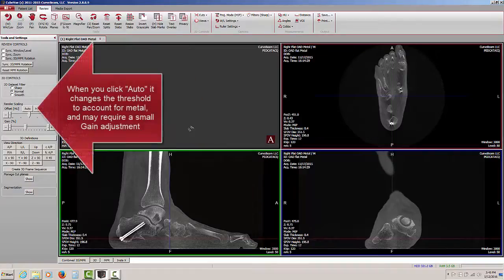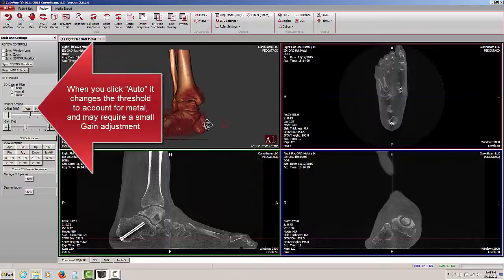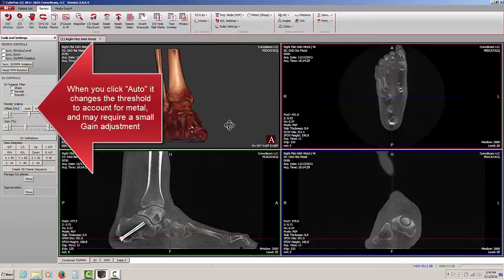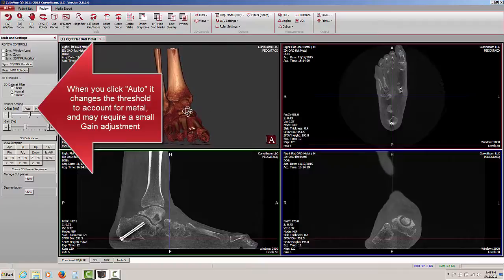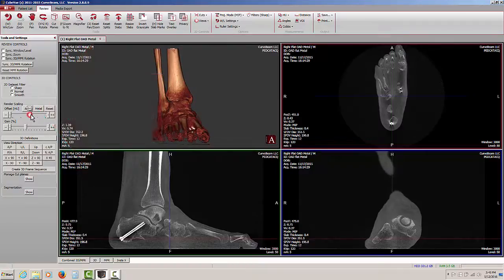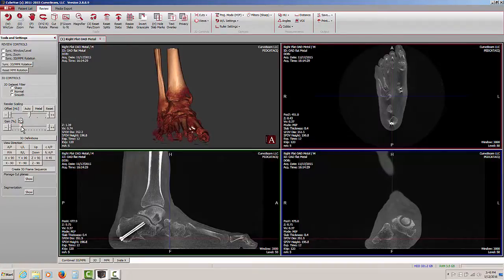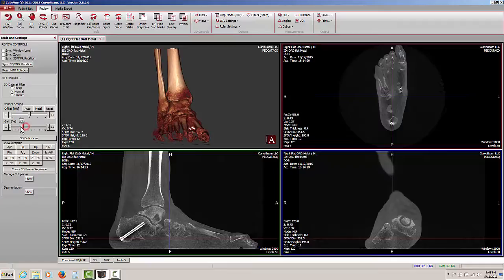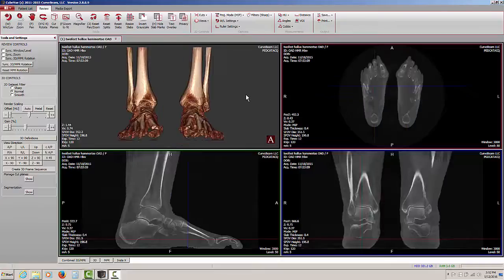Resetting this again, a third option is to hit the auto button. This typically seems to work the best, kind of places us right in the middle of showing the bones with very little soft tissue and only some minor adjustment is required. You may also have to go to the gain slider to make it look more like the image you're used to, sliding it to the left, removing some of the red, making the bones more whitish in appearance.